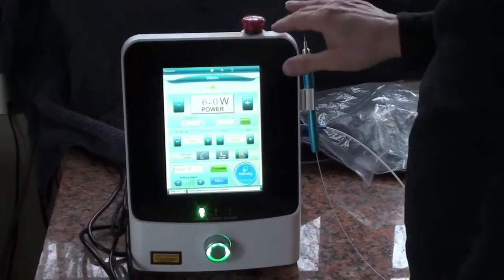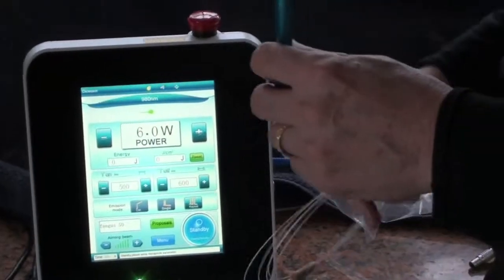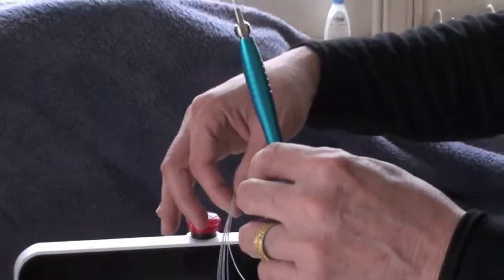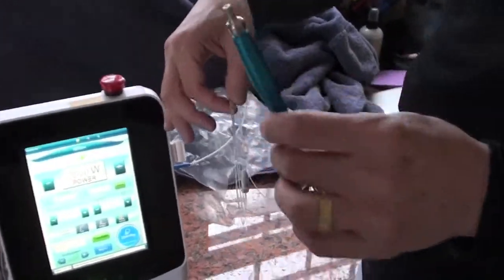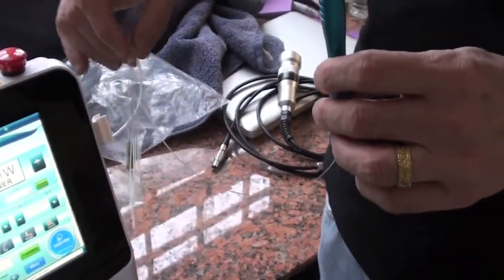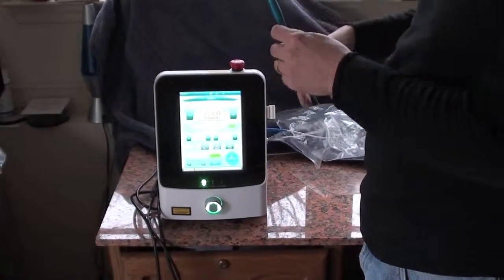Okay, we're going to switch from the surgical handpiece. And by the way, I want to point out the surgical handpiece. I find this to be the best and easiest way to use it. We do have a wheel, we have an antenna, but this is just so easy. You use a piece of tape or a twisty, and you can take it off and extend it. It's so easy to use this, and it doesn't get in the way. I highly recommend this setup as opposed to the manufacturer at this time.